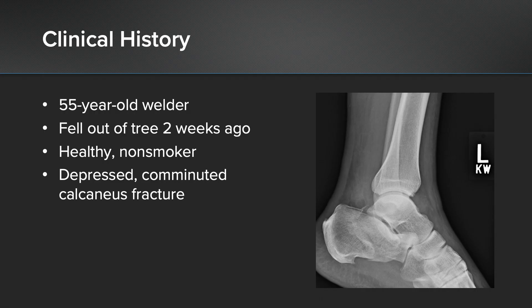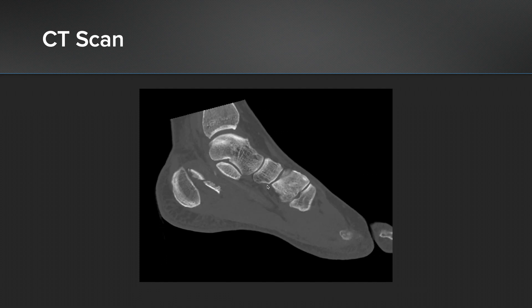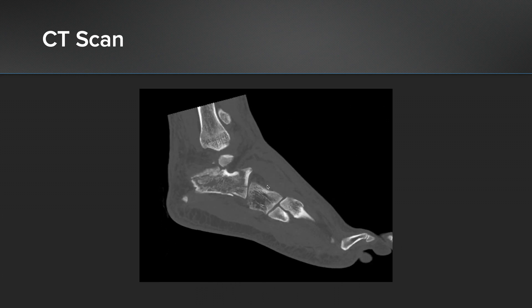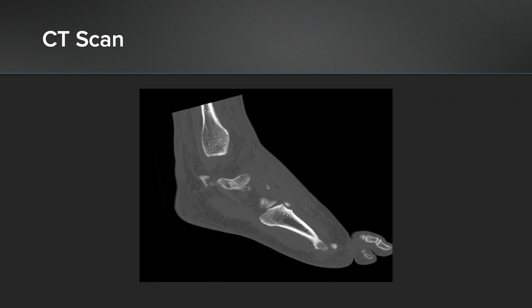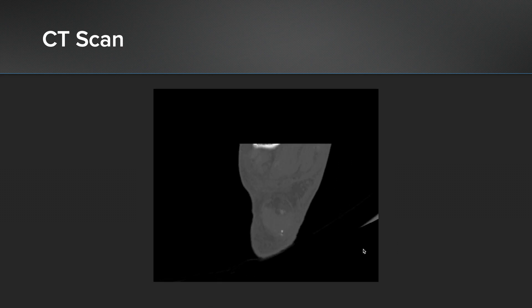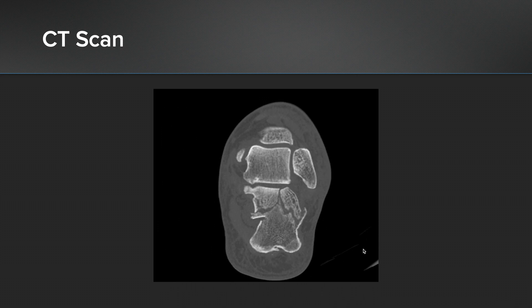Clinical history: this is a 55-year-old welder by trade. He fell out of a tree and presented to me about two weeks later. He's healthy, non-smoker, and as you can see on the x-rays on the right here, he's got a depressed comminuted calcaneus fracture. I sent him for a CT scan. This representative sagittal cut shows the depressed fragment and the intra-articular fragment. A coronal view shows the intra-articular split in the posterior facet and medial comminution as well.